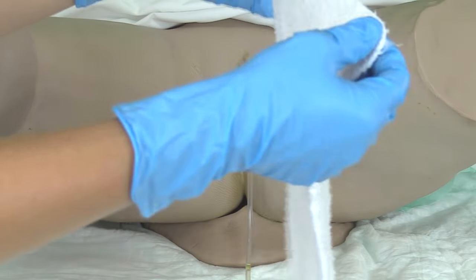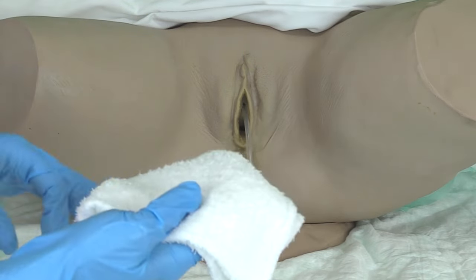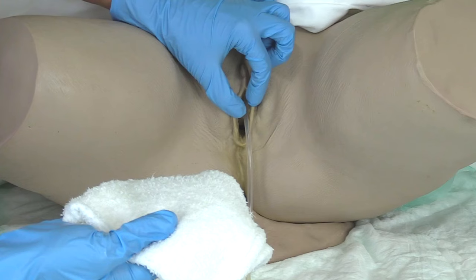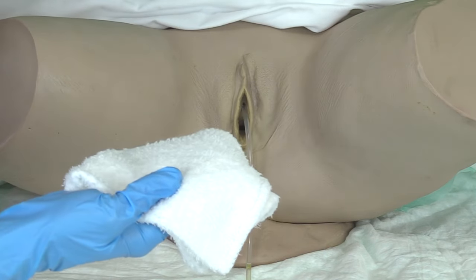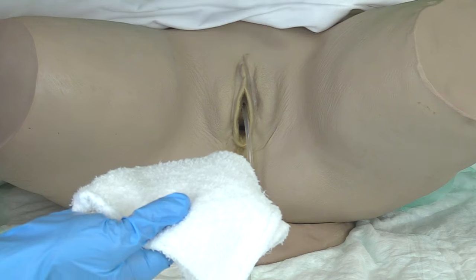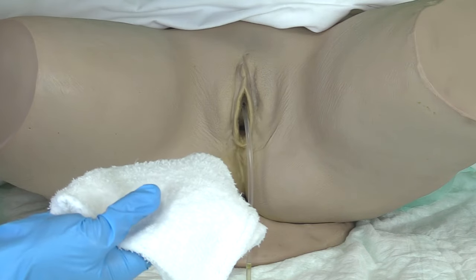So first what we're going to do is get a washcloth with soap and water on it, and fold it in half, create your leaves. Very first thing we want to do is tell the patient we're going to be spreading labia. Specifically, we're going to be spreading the labia minora because we're going to clean this catheter line. And what we want to clean first is the first 2 inches where that catheter is going into the urinary meatus, so at that medial junction. And we're going to be careful not to put tension on the line, so we want to clean that first.